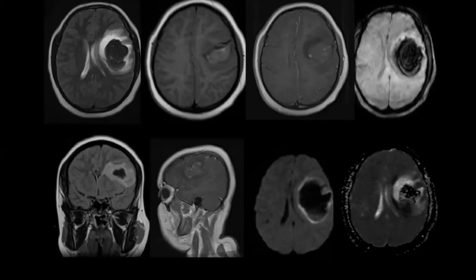On T2, the center is hypointense with surrounding hyperintensity, which is most likely edema due to the hematoma. On T1, it's isointense to the surrounding brain parenchyma. On GRE images, the center of the lesion is showing blooming artifact, which goes with hemorrhage. The last two are the ADC and the diffusion weighted images, which do not show any restriction of diffusion. So most likely this space occupying lesion is not any mass or malignancy. It's most likely a hematoma.